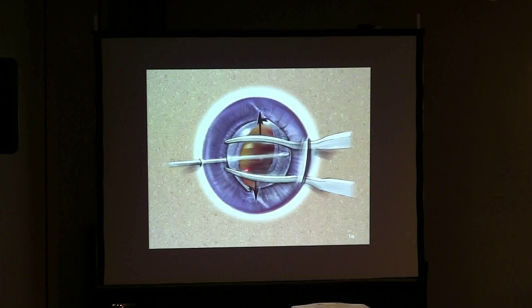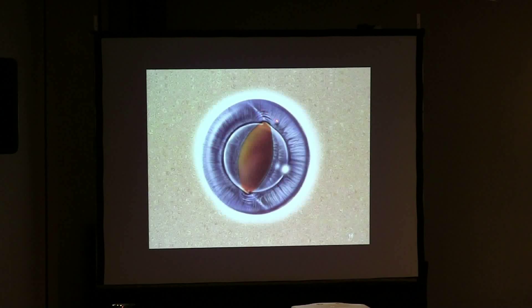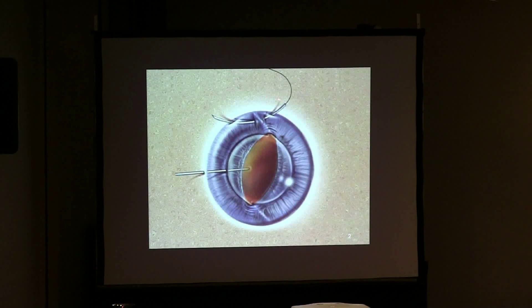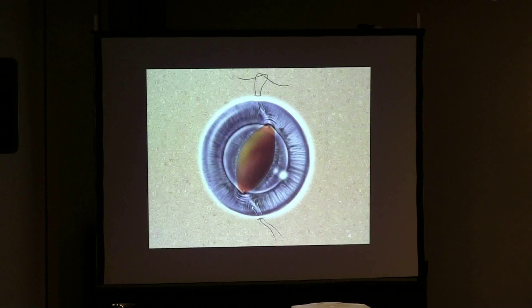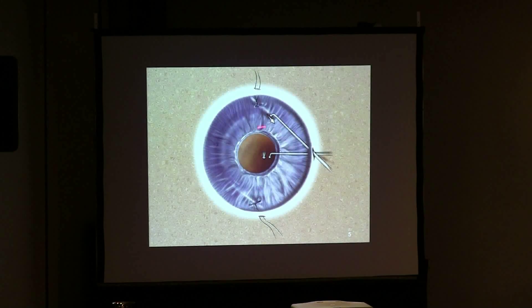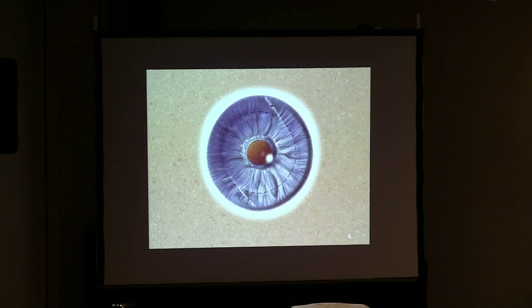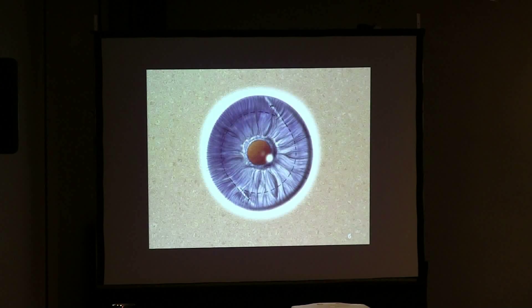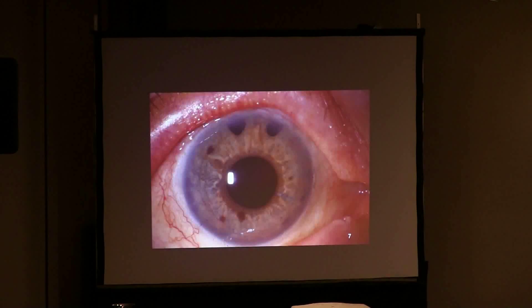Having a second instrument holds it in place. Once you are done, you lift it up a little bit and start seeing your haptic silhouettes — this is what we call the cat eye capture technique. You pass the suture through the cornea, through the iris, under the haptic, through the iris again, and back through the cornea. You externalize your stitches, tie them, and push the lens back. The whole procedure should take about 12 to 15 minutes.